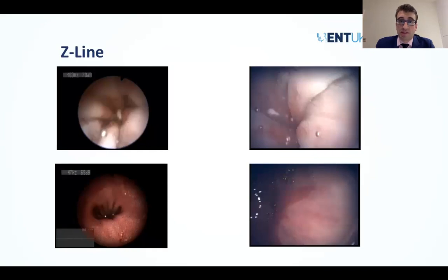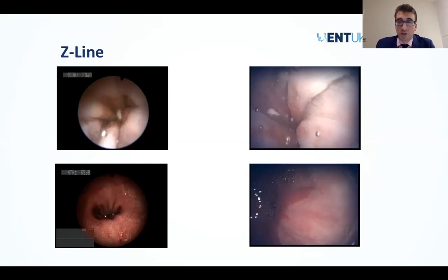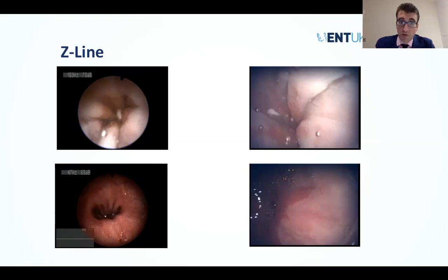Like with anything else, the first thing to know is normal anatomy before discussing pathology. There are certain basic concepts important for the endoscopist to familiarize themselves with — concepts gastroenterologists are of course much more accustomed to. Recognizing the Z-line, which demarcates the squamocolumnar junction of the esophagus between squamous epithelium (whitish-red, proximally) and columnar epithelium distally (more salmon-pink), is key. By recognizing the normal Z-line, you'll be able to see whether the columnar epithelium is spreading proximally, suggesting esophagitis or Barrett's esophagus.